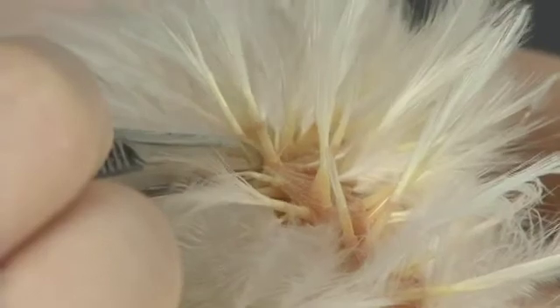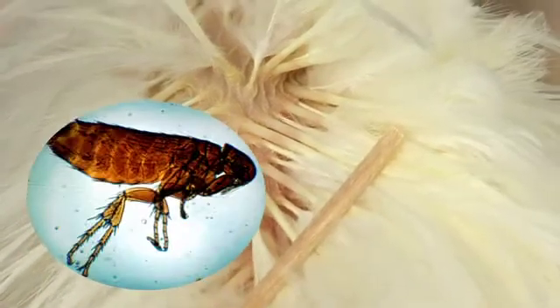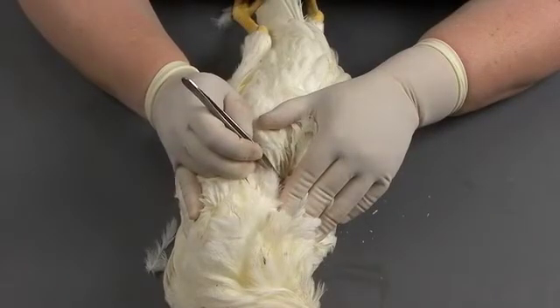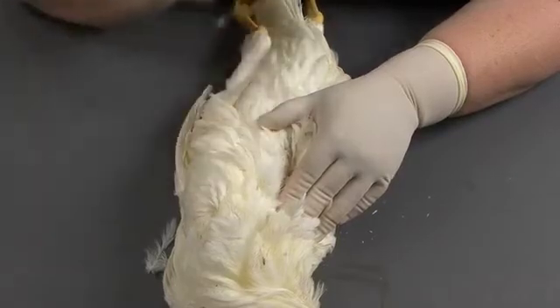Move the feathers aside and examine the skin across the entire body surface. The skin is normally very thin, and the amount of pigment varies from pink to black. The skin should be free of exudate and have little or no scale. Look for any lesions or evidence of ectoparasites. Some species of parasite inhabit the surface of the skin, while others are more likely to be found on the feather barbules. If parasites are present, they can be collected and submitted for identification.